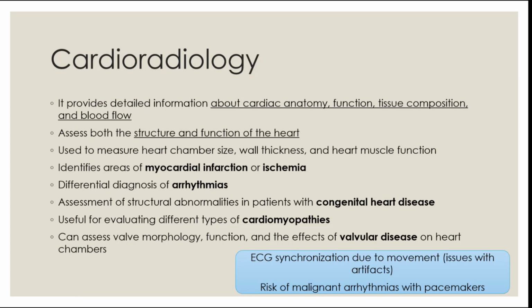Now, in MRI sometimes the patient would move, and this would produce artifacts. In order to have a better quality of image, they usually synchronize it with the ECG. And this is also for CT. It's important so that you have a better quality of the image. And as we mentioned before, for contraindications, there are pacemakers, and there is a risk of malignant arrhythmias with pacemakers.